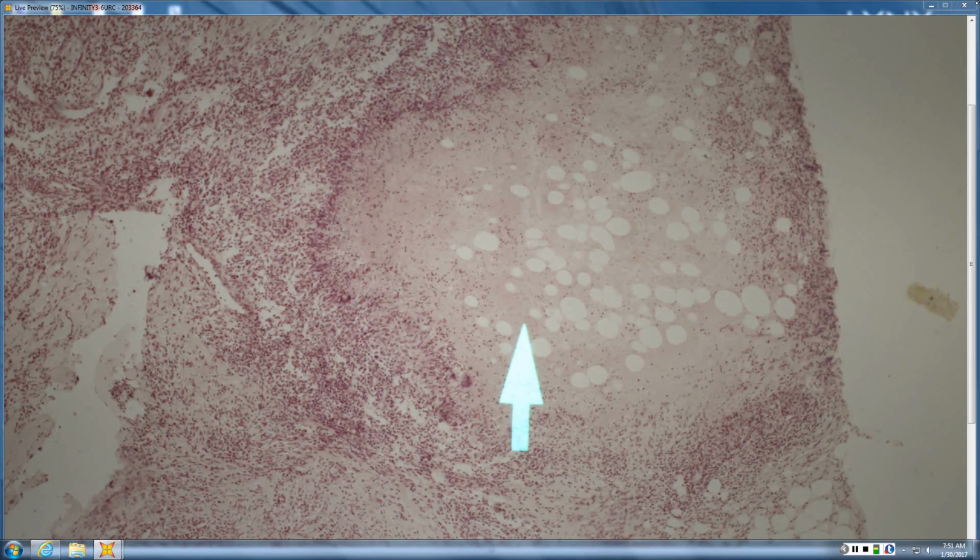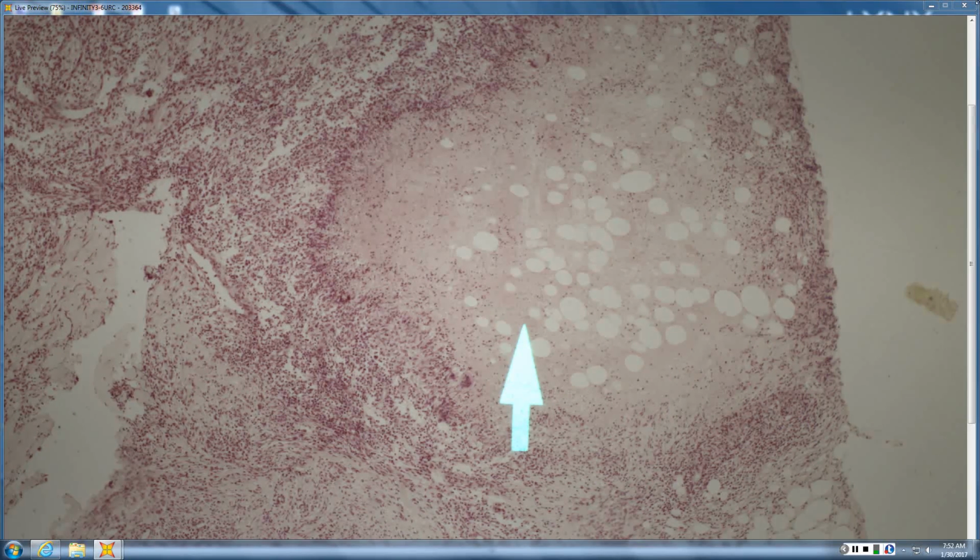Is that fat healthy? No. So it's like a lot of thickening around it, pycnotic nuclei, and it's very pale. Fibrin stains more intensely than anything else. This is staining less intensely than anything else, so it's just dead. Anything that you know that forms palisaded granulomas around a dead center, like tuberculosis. So that's kind of a typical caseous necrosis granuloma.